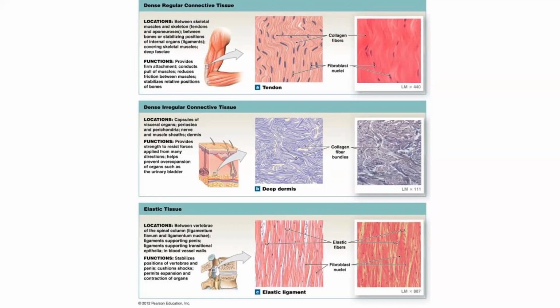What I recommend my students do for this is to look at the overall histology slide and to see if you can draw an arrow that best represents most, if not all, of the elements in the histology slide, specifically the direction in which they're going. So what I mean by this is, in this scenario, I can draw an arrow up or down to represent the direction in which most of these structures are traveling.